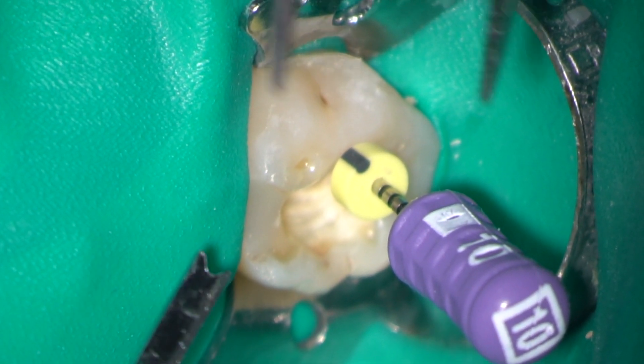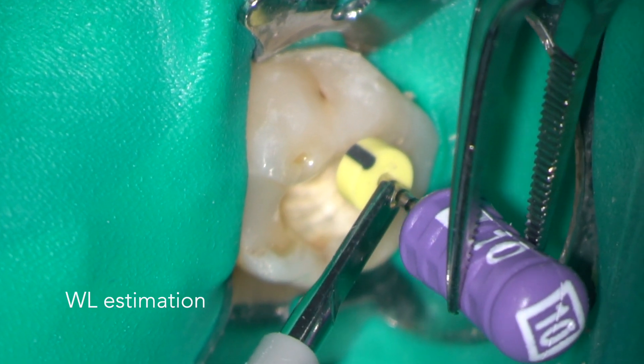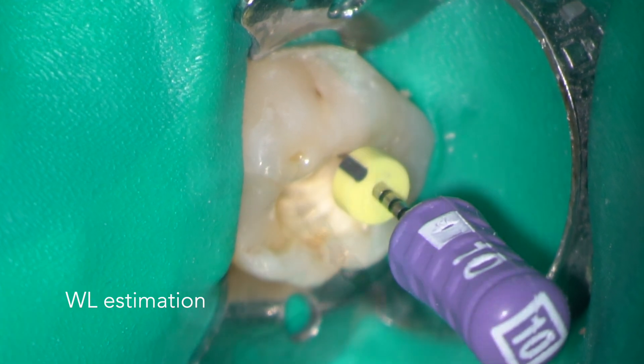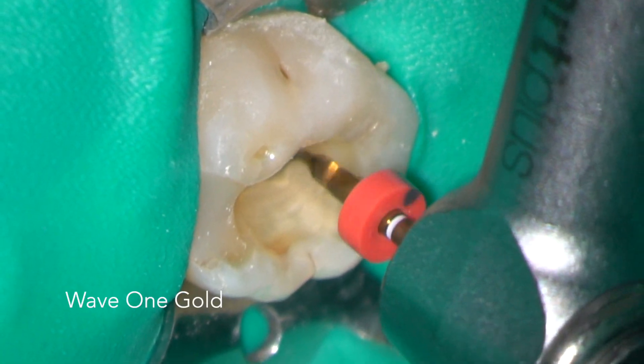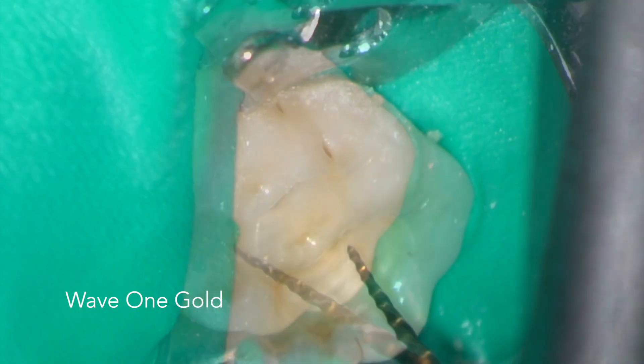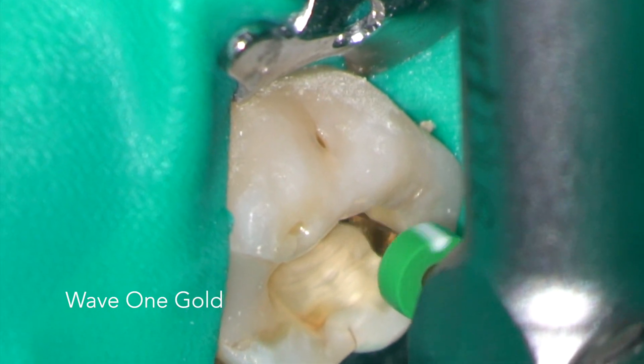The working lengths were all estimated using an electronic apex locator. The canals were then rapidly tapered using Wave One Gold instruments: primary, medium and large.